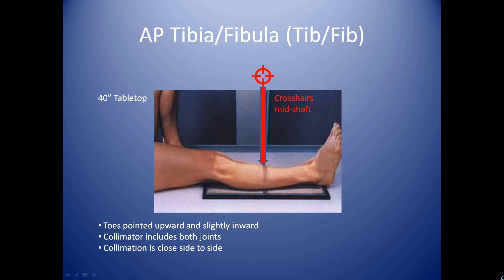You're working all the way from the lower portion of their upper leg down to their ankle, so you'll need them to give you the ability and space to do so. You'll have the patient extend their leg completely so that their knee and their ankle are flush against the cassette as much as possible. Your camera tube is pointing directly down, and you're going to want to center your crosshairs mid-shaft, which is halfway down the lower portion of the leg.